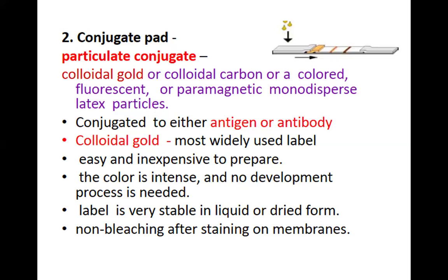We can get a lot from one preparation, but the problem is the antibody, because if we use a very low concentration, then we might not get the test line at all. But we also cannot use too much. If it is highly concentrated, then it will also inhibit the reading.